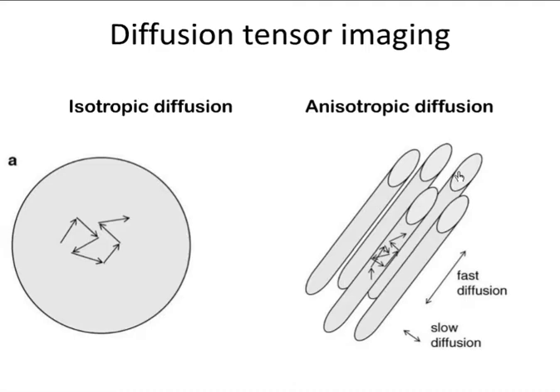So another development in terms of MRI technology is the use of diffusion tensor imaging, which tells us not only something about the ability or the probability of water molecules to diffuse in the brain, but also something about the directional preference of those water molecules. By analyzing the directional preference of the water molecules, we can also make inferences about the integrity of, for example, white matter tracts and whether or not they are damaged.